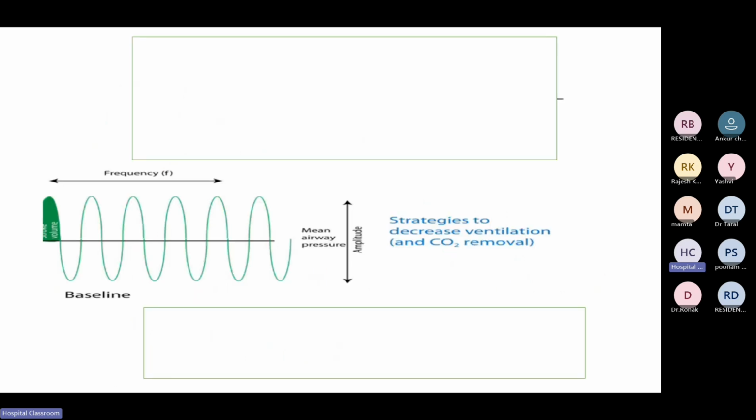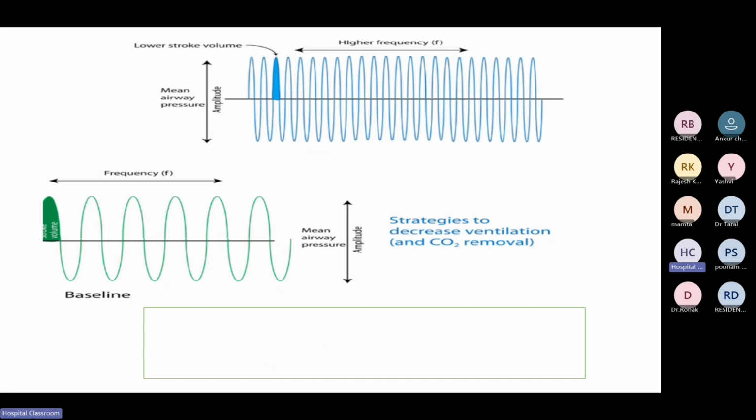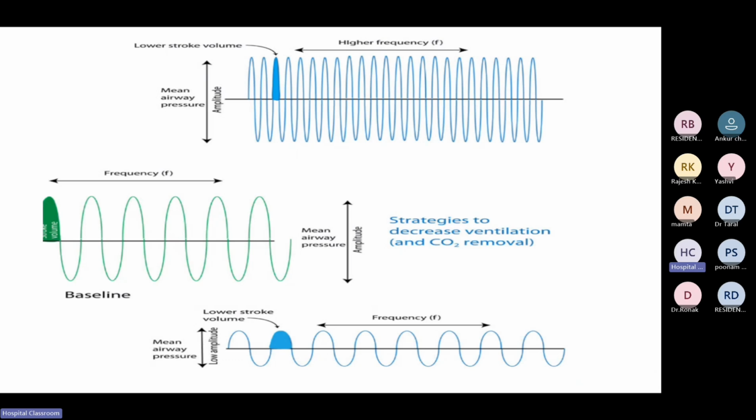Similarly, if you want to decrease the CO2 removal, there are two strategies. One is that you increase the frequency or you decrease the amplitude.